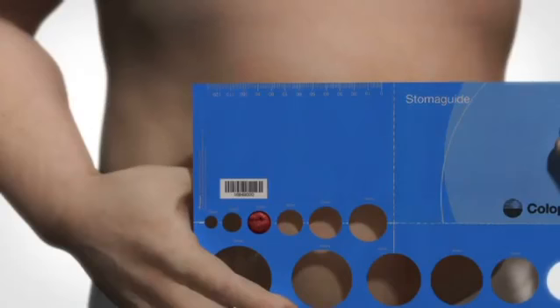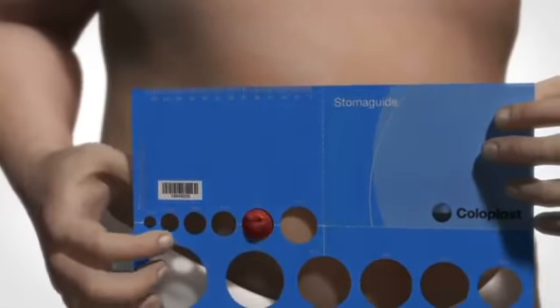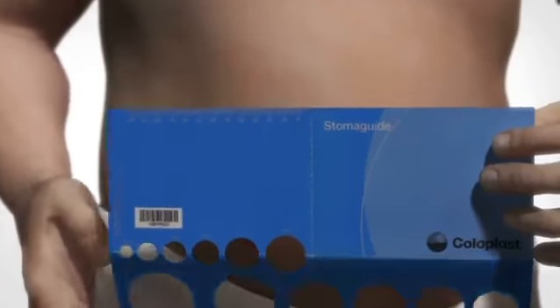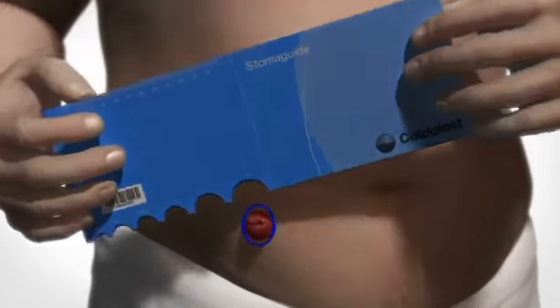If the hole is too narrow, the adhesive will not adhere properly. The hole must fit precisely to the size of your stoma. If your stoma is oval, measure the different diameters of the stoma using the half circles of the stoma guide.